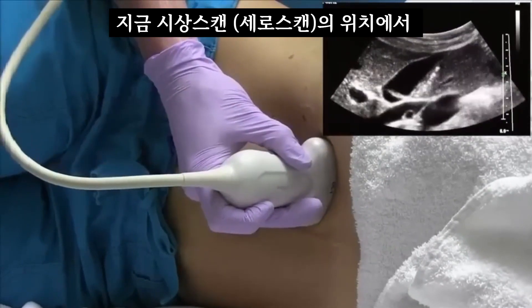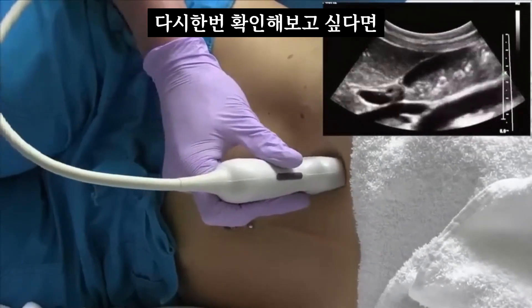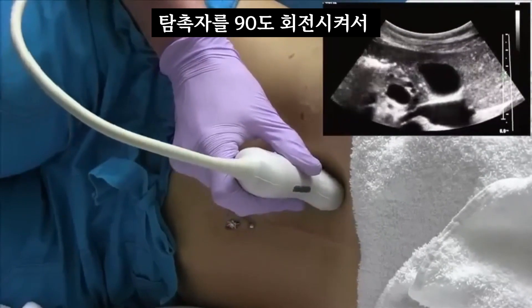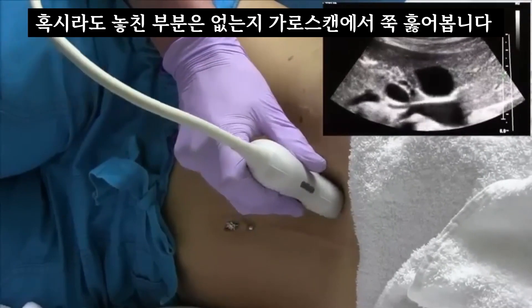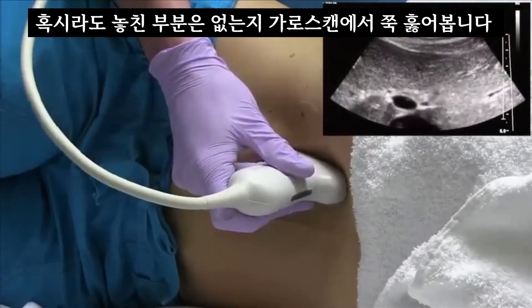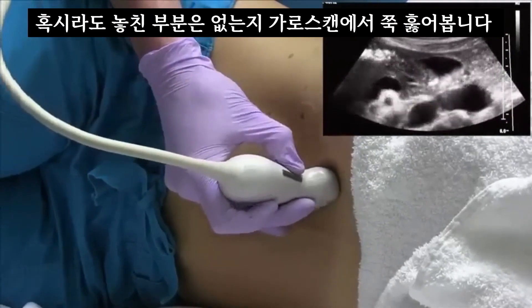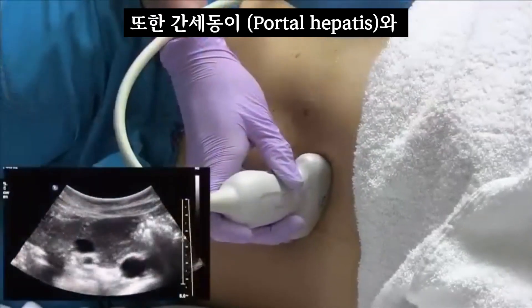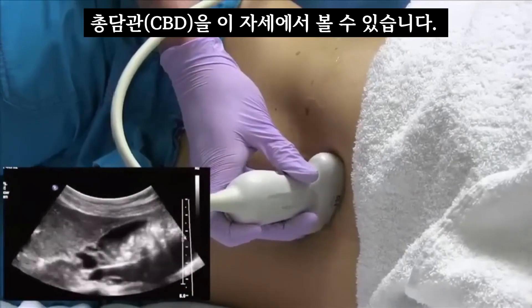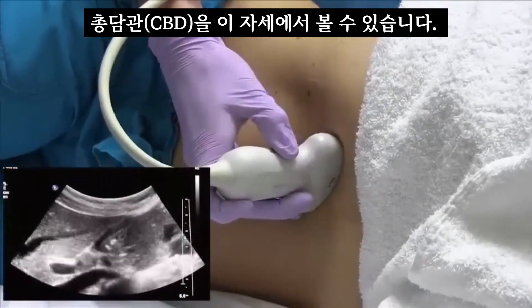Once you get your sagittal sweep, you're going to want to turn your probe 90 degrees and sweep through in a transverse plane just to make sure you're not missing anything. You can also see the porta hepatis and the CBD from this decubitus position as well.